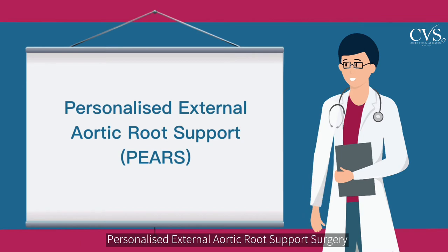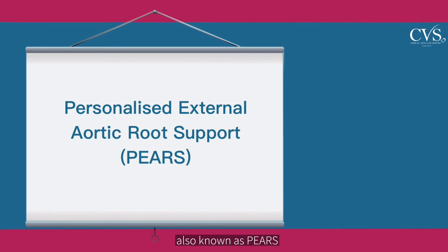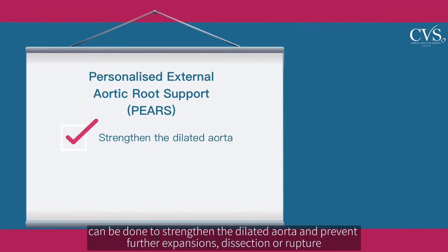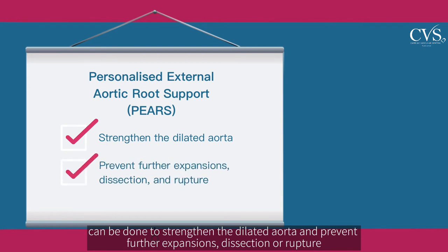personalised external aortic root support surgery, also known as PEARS, can be done to strengthen the dilated aorta and prevent further expansion, dissection, or rupture.